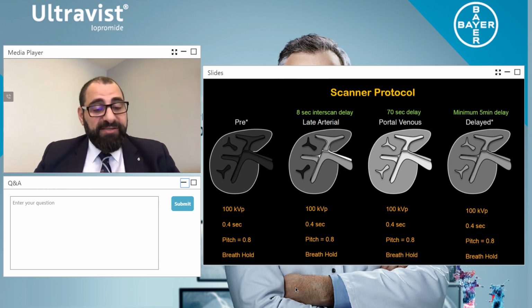A good question. Depending on what contrast media you're using, this is where the biggest factor of the LIRADS is, and this is why we've had 12 iterations after the LIRADS, which was done in 2006, that we need longer waiting times for contrast. Now, if a patient is dehydrated, blood flow is going to move a lot slower and it's more sluggish. Second of all, the saline, if you're not using saline to push it, which is another factor. And third of all, if the contrast is not like the viscosity of blood, this becomes another factor. So yes, 3 to 5 minutes, but in actual fact, 10 minutes is ideal. So this is what we do in our institution.